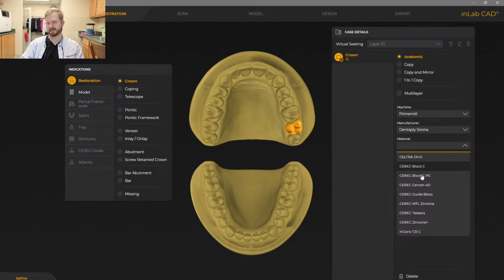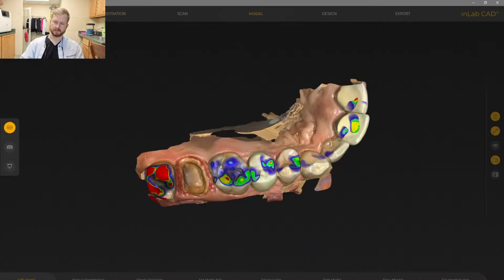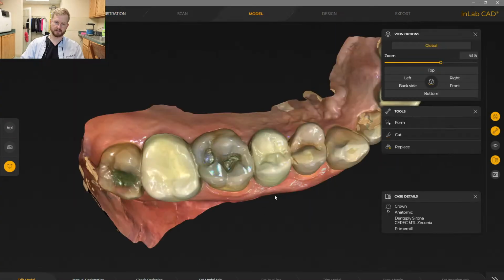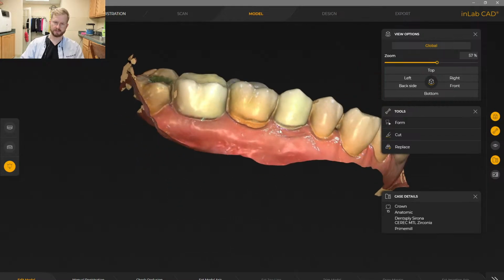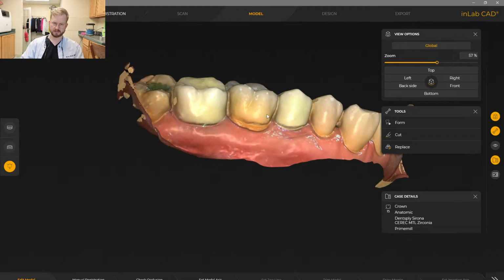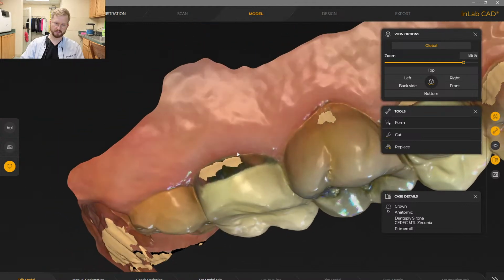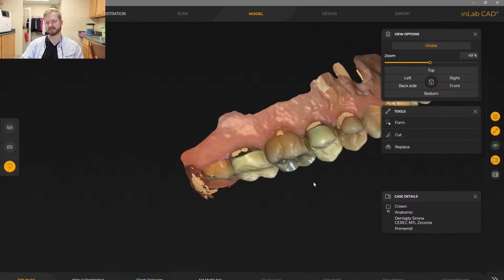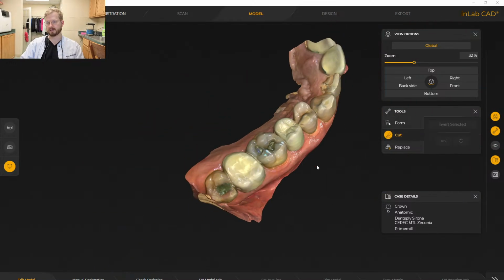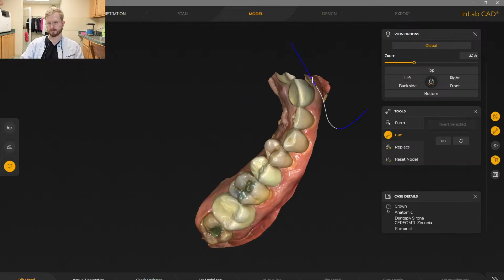The patient presented with an existing crown that had terrible margins that eventually developed recurrent decay. So it's a cavity underneath that old crown. You're not really going to be able to tell in the pre-op, but this is what the tooth did look like. If anything, I would say it's over bulky, but you could take an explorer and fit it all the way up underneath that margin. She had like a 1 millimeter gap between the tooth and the margin, and eventually it just got a cavity. So we cut it off, removed the cavity, prepared the tooth for a new crown, and that's what you'll watch us do here in the next 10 minutes or so.